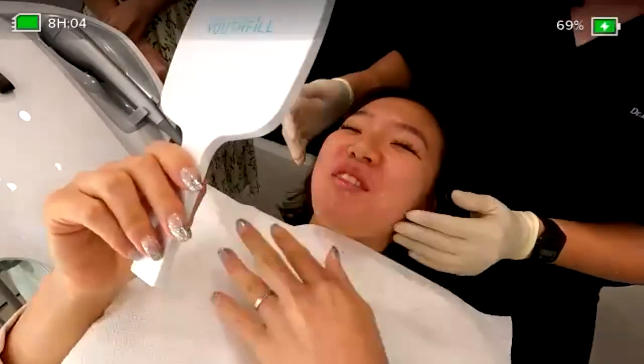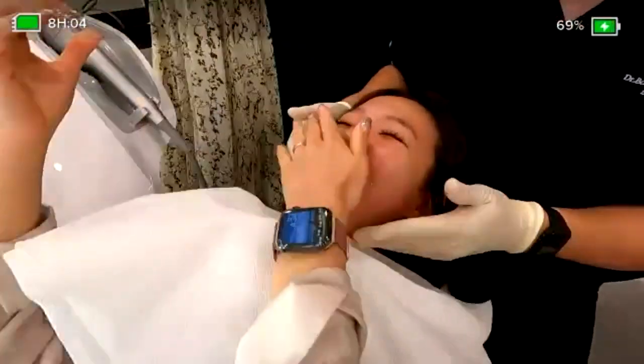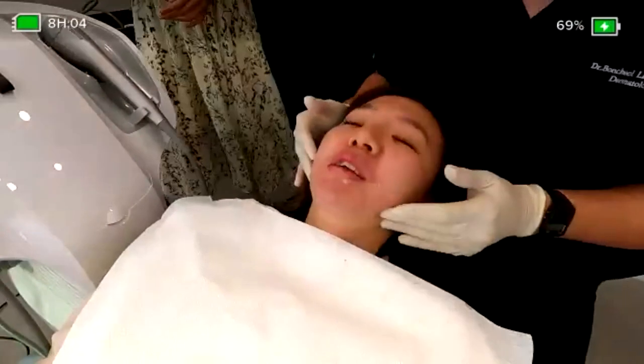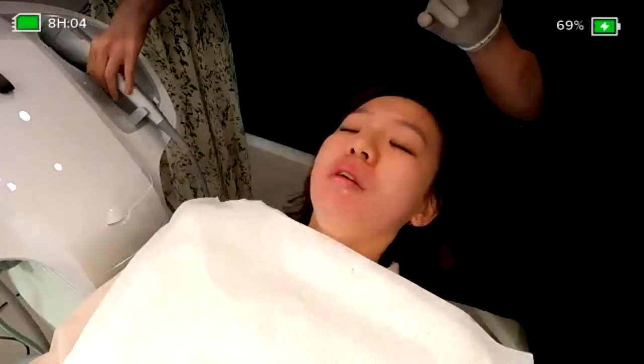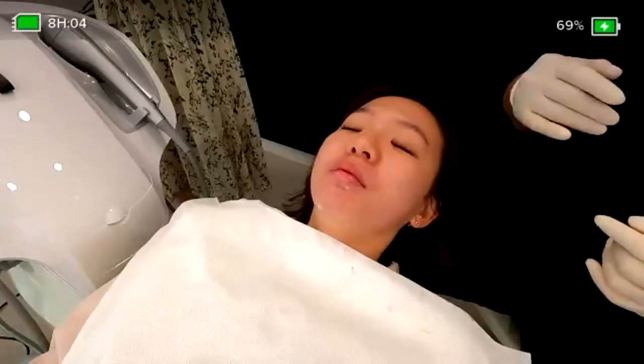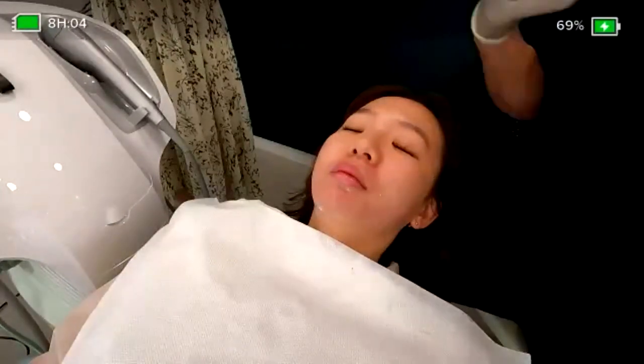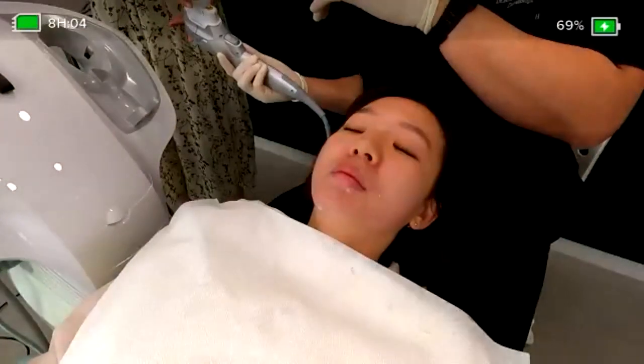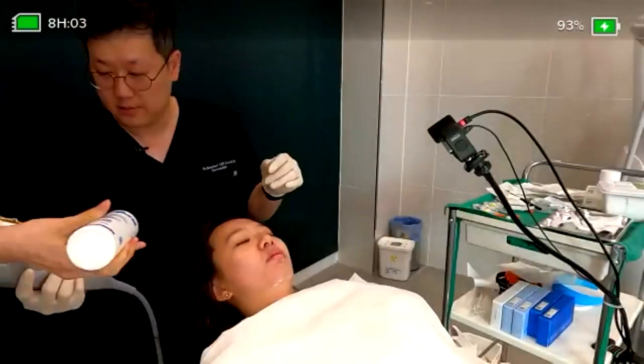Okay. So she is very satisfied with these contours compared to this contour. This is the happiest moment for the doctors for how this kind of work goes. So we'll go again to a side-by-side treatment with 3 millimeter treatment here.